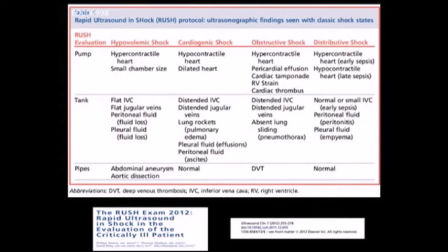So I'm glad I could cover part 1 of the RUSH exam, evaluation of the pump, in this video module. I hope to see you back as Soundbites continues as we move forward to look specifically at part 2, evaluation of the tank, and part 3, evaluation of the pipes in the RUSH protocol.